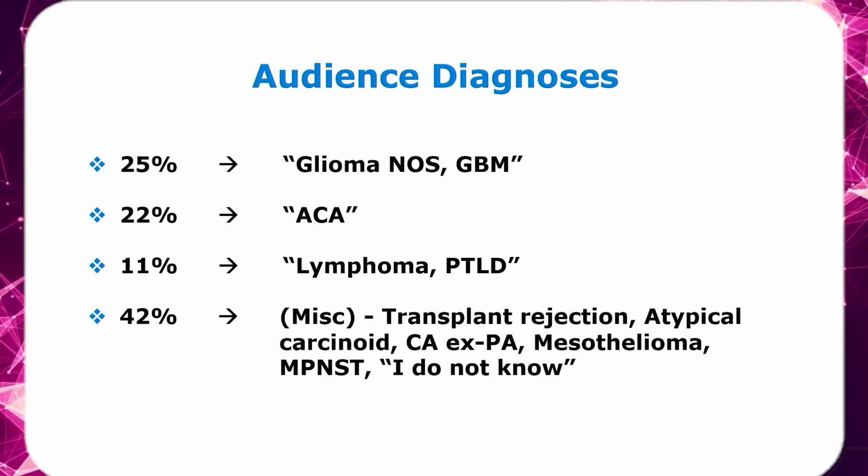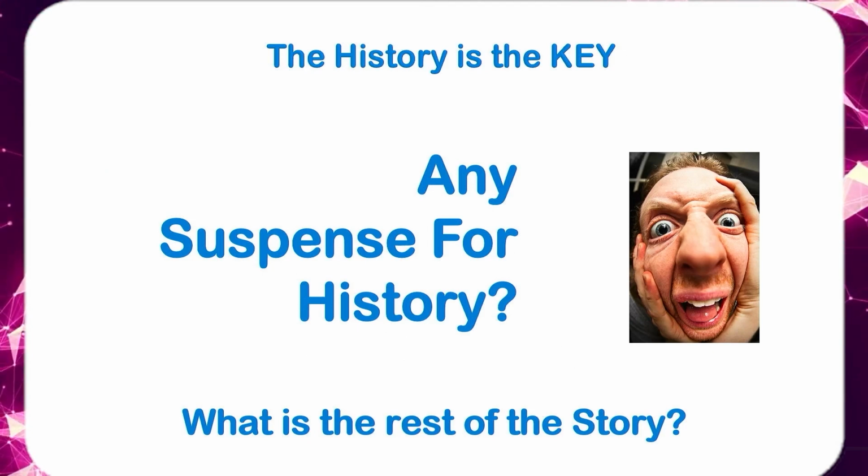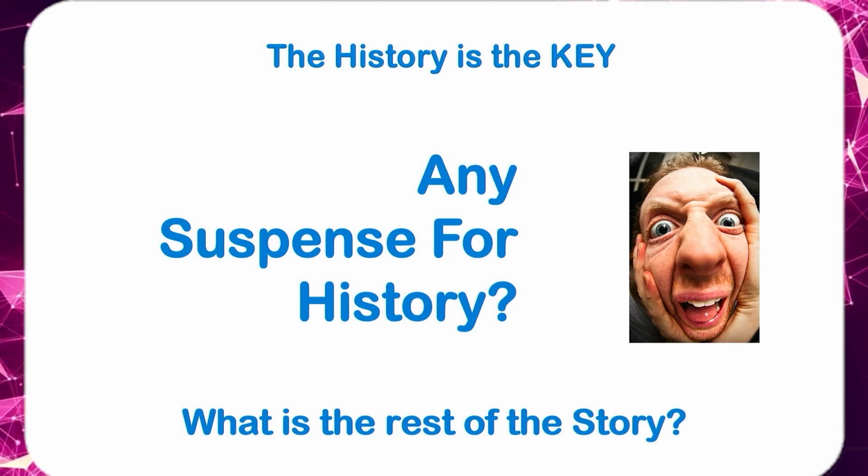So what do you think is going on? History is the key. That's you holding your face. So is there any suspense for history? Where is the rest of the story? So when you say we all give up, I'll give you the history. Mudassir, you have to say you gave up, then I'll give you the history. You give up? Yes. Okay.